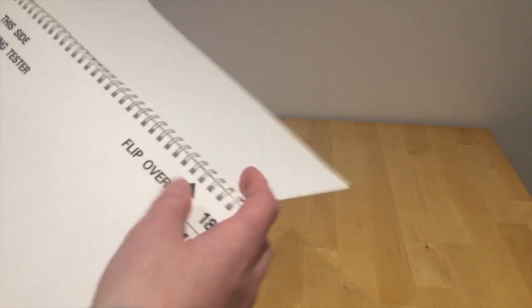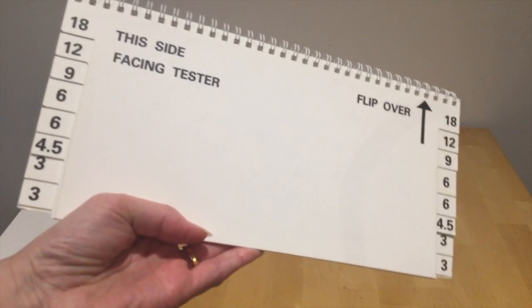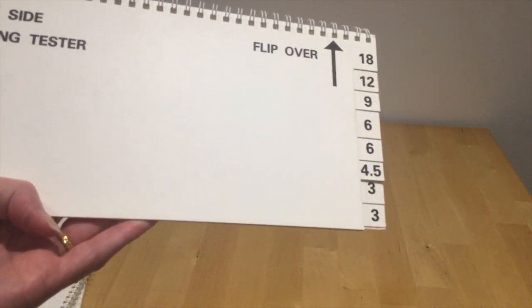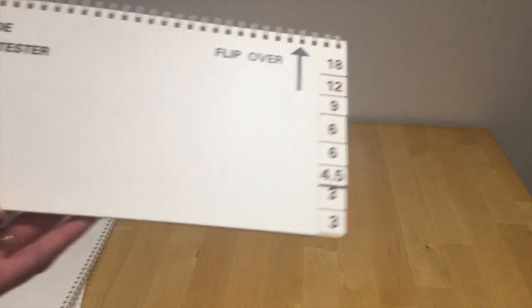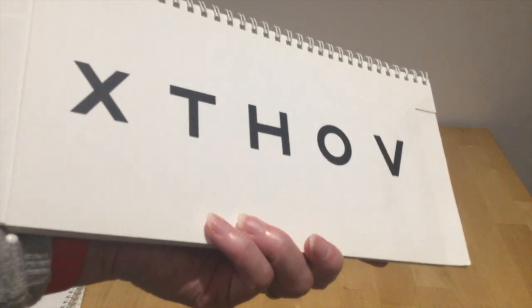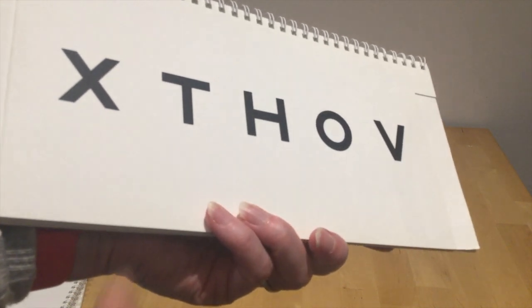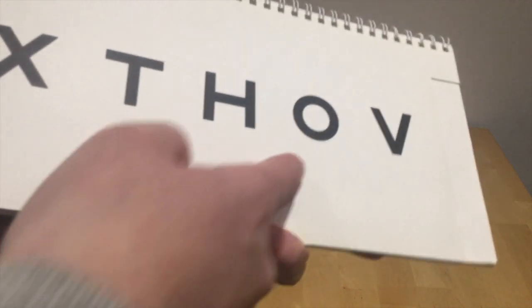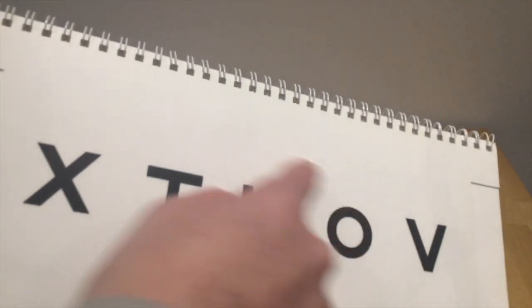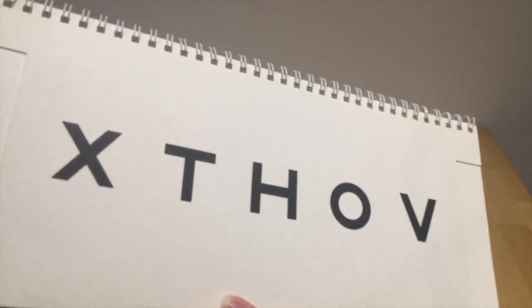From there we go on. If we've managed to name all of those, we go into our next book. Again, the side facing tester, flip over, and we have all the sizes down here. Again, you could either ask a child or young person to name or match all of them, or choose some from these, because there are 5 letters here. Choose one of those 3 in the middle, not the end.